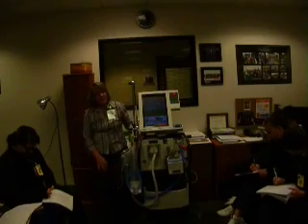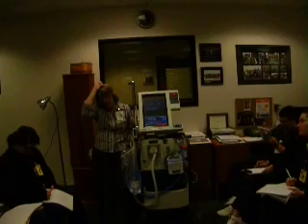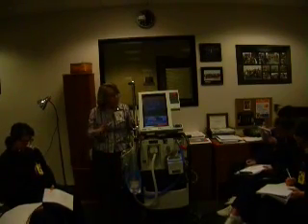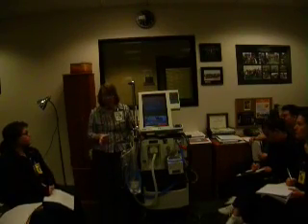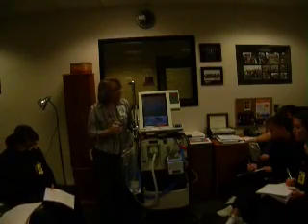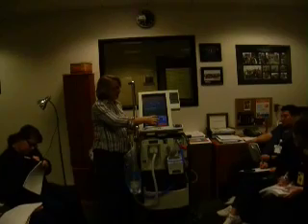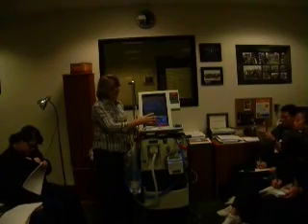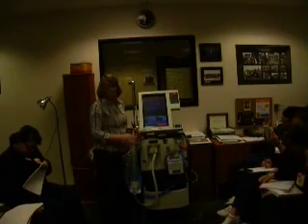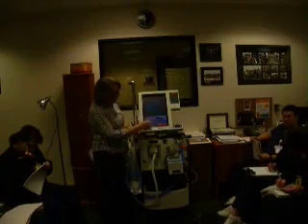So remember, you guys, when you're going to the vents for the first time, when we first started talking about them, I told you there were 4 main components to every ventilator. And once you learn how to manage a vent, you can run any vent. You just need to find out where those 4 sections are. So one was where we set our set parameters. That's where this is right here on this ventilator. So now we've told it what we want it to give our patient. We've set everything. That's where everything's at.